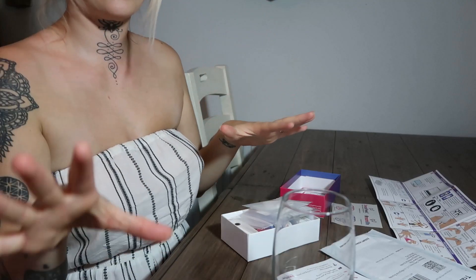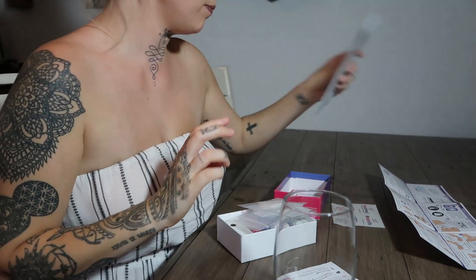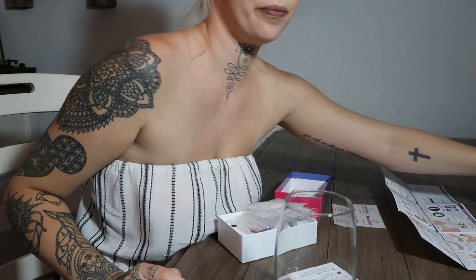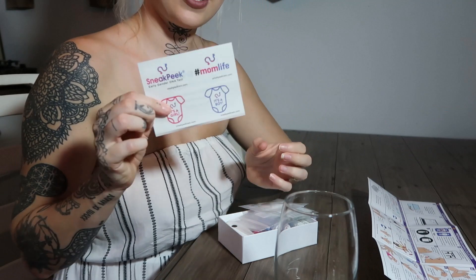So I moved the angle of the camera slightly so you can see what's going on. We don't need that - that's the envelope to send it back in, so we'll put that there. That's the instructions, so we do need that. That we don't need right now. We don't need that box right now. And we don't need these stickers now.